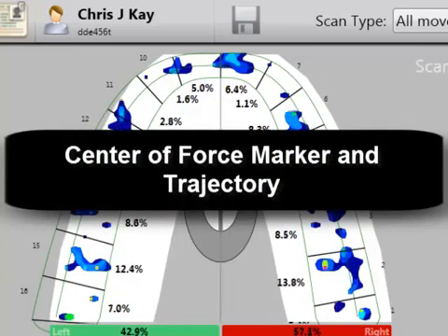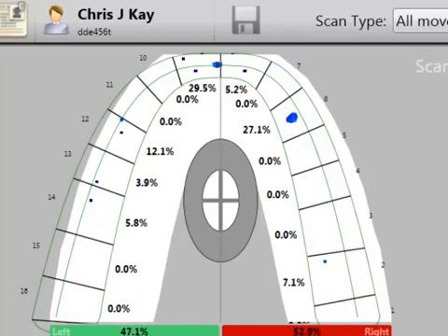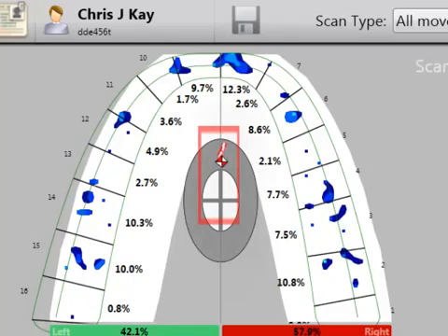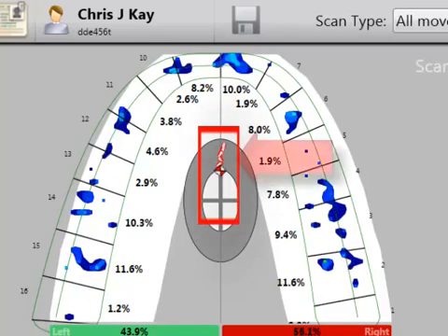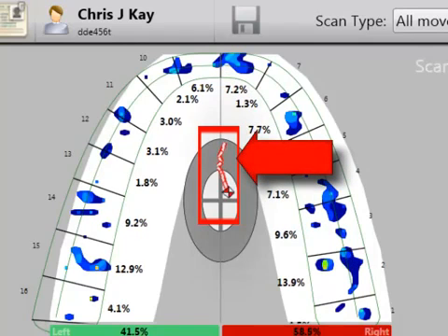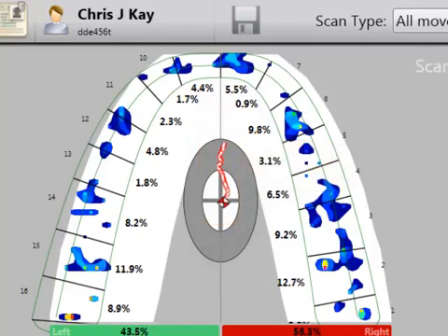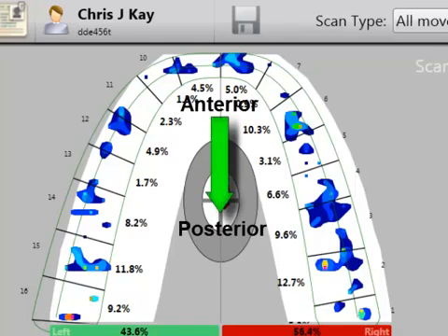The Center of Force Marker is represented on screen by a red and white diamond in the 2D movie window. The trailing line displays the path that the center of force has traveled while biting. In general, balanced forces are characterized by a pattern that travels anterior-posteriorly along the midline.